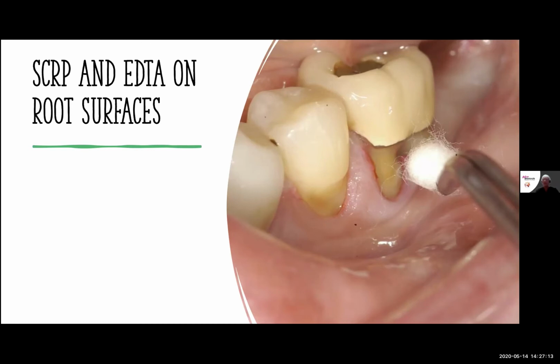I start by scaling and root planing, and then I'm going to flatten the surface of the root with a round burr. If there happens to be a composite that is here, I'm going to remove all of the composite and get down to the root surface. Once I've done that, then I'm going to rescale and root plane, and then use some EDTA on a cotton pellet. EDTA is just an agent that helps gum tissue to heal and to grow a little better onto the root surface itself. And so the EDTA is used just over the root surface, and then at that point I'm ready to begin the tunnel process.